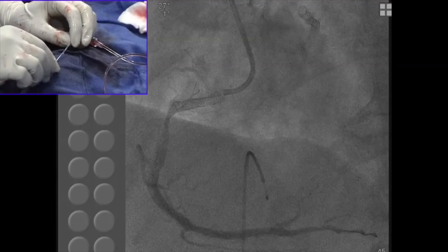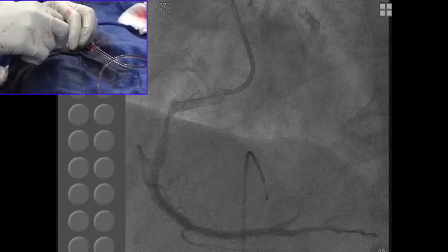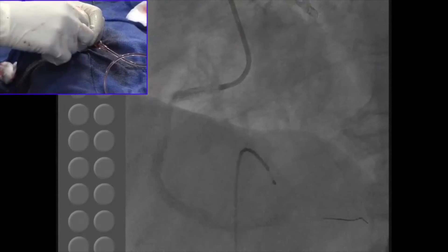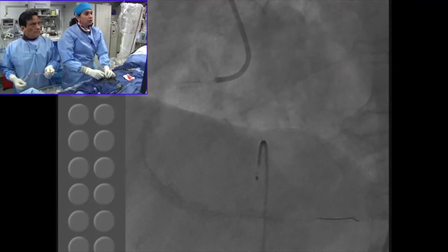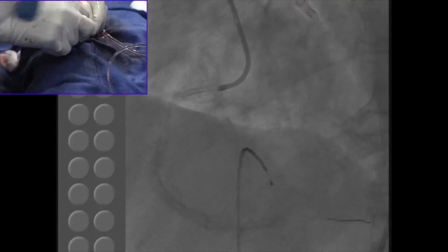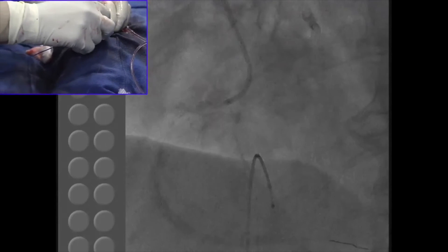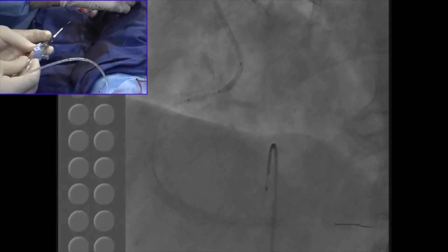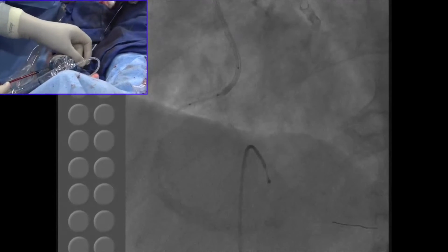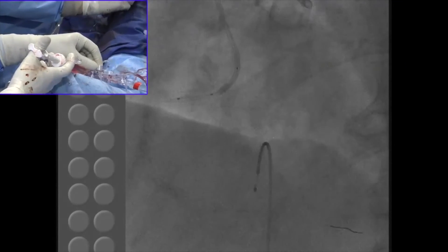The whole technique here is very precise positioning — precise positioning of the mid marker. The mid marker at the ostium of the stent. Looks a little distal — I will pull the guide out.